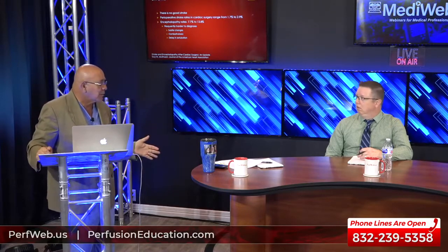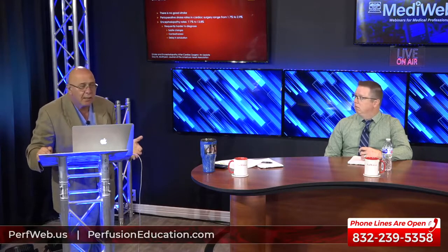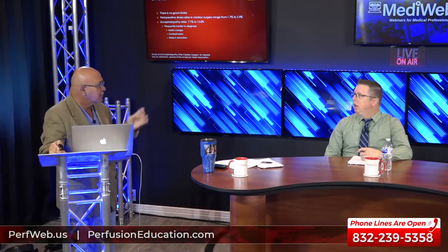Okay? So you're saying use it as a trending device versus an absolute device? Absolutely. I don't think you can get an absolute number. No one can convince me there's an absolute number because it isn't an absolute number. But if you're going to use it, then use it. If your pre-op value is 60 and you go on pump and it's now 38 or 40 and your hematocrit is 18, 20, and you can't flow anymore, make an adjustment. We don't like to give blood transfusions, but guess what? I feel you are obligated to give that patient a transfusion. I feel you have a responsibility at that point to treat that. If you're going to use it, then use the data. Absolutely. That's how I feel about that.